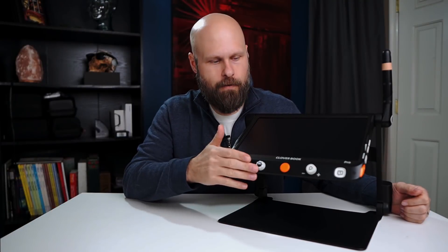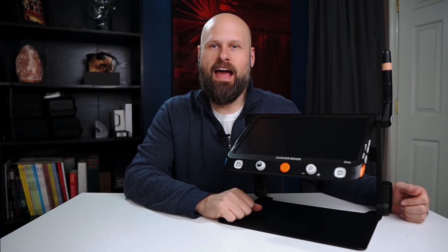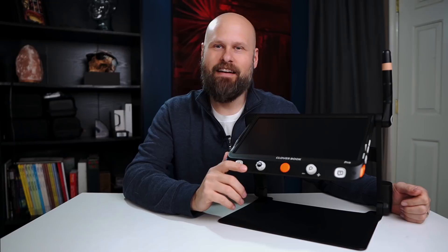Today we're taking a look at the CloverBook Pro, a new portable video magnifier, and it might just be the best one we've ever had on the channel.